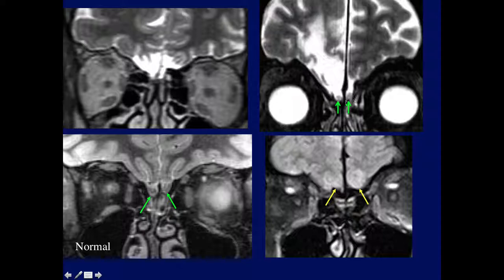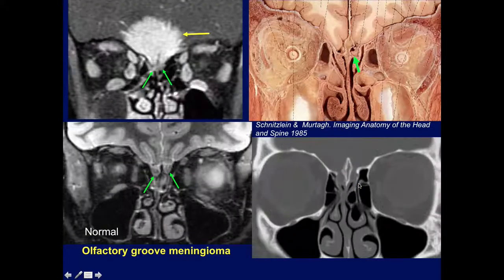On one side where the trauma was, we see a smaller olfactory bulb. With early trauma changes, we'll see edema involving the frontal poles. This is a classic olfactory groove meningioma — we can see extension into the region of the cribriform plate, and we can see the nerve still visible below it. This is rarely mentioned in reports but is important because eventually it will cause symptoms in the region of the olfactory bulb and tract.